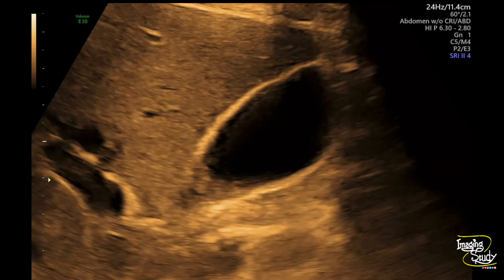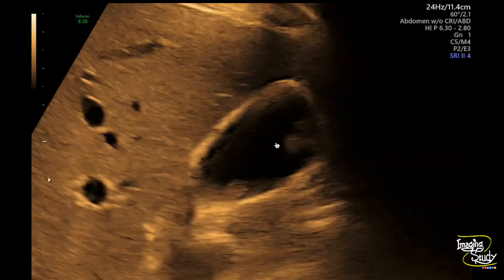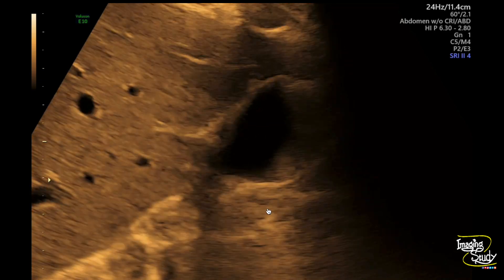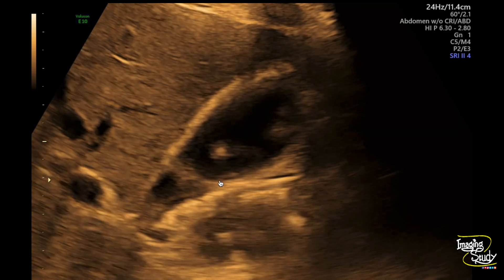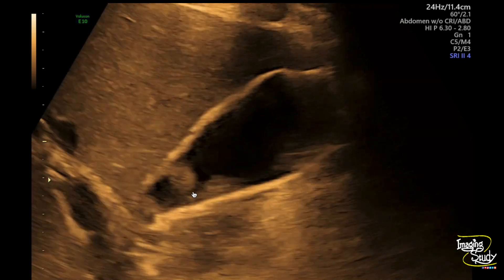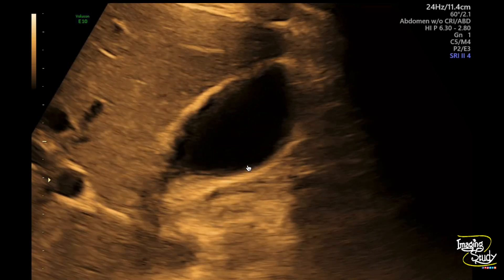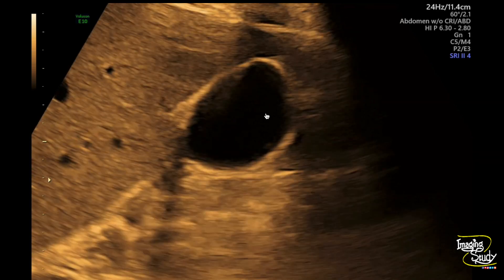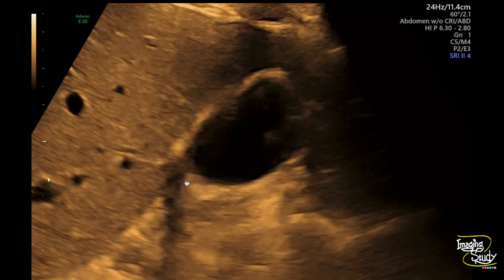Here you can see the longitudinal section of the gallbladder. It's a little magnified view. You can see multiple echogenic structures arising from the gallbladder wall, protruding into the lumen but not casting any posterior acoustic shadow.